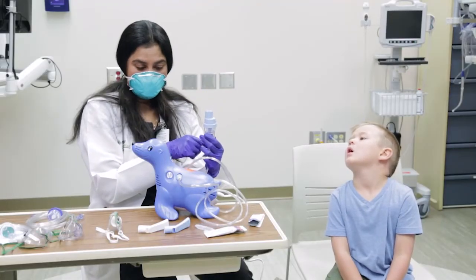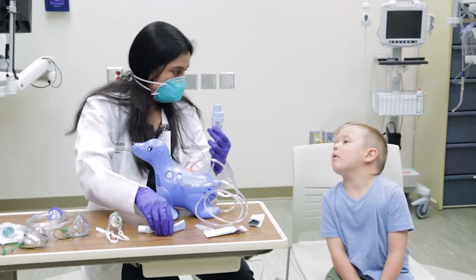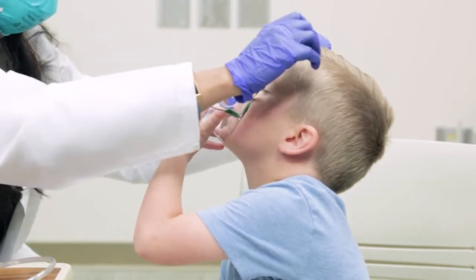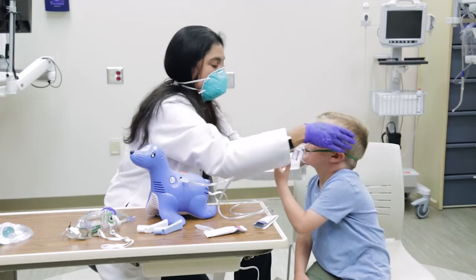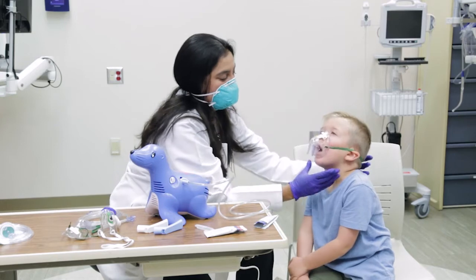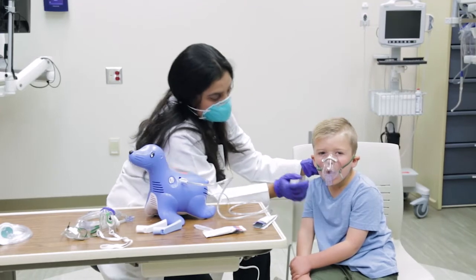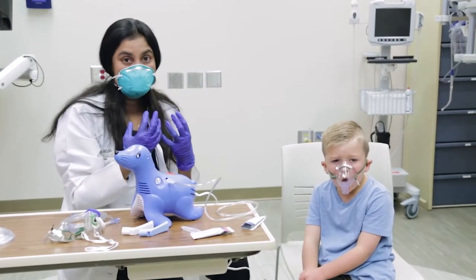Now, depending on your child's age, we can either use a mask or one of the mouthpieces. Ben, how old are you? He's four. So usually when you're four years old, you tend to use a mask because it is a better fit for the child's face and it prevents spillage. You can help the child by adjusting it so the bridge of the nose is where it sits and it's covering the mouth. Kids his age, when they breathe in, are going to breathe both through their nose and their mouth, so it's important that the mist goes in there.